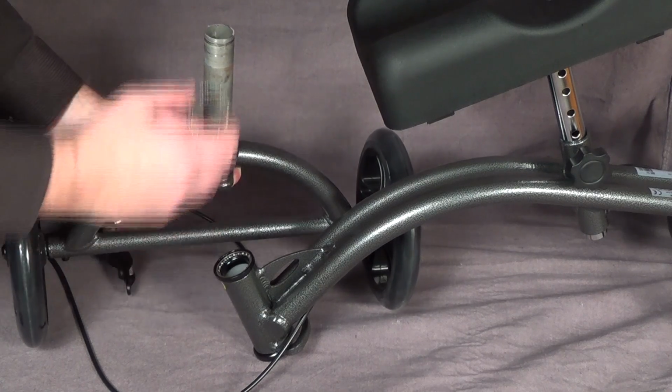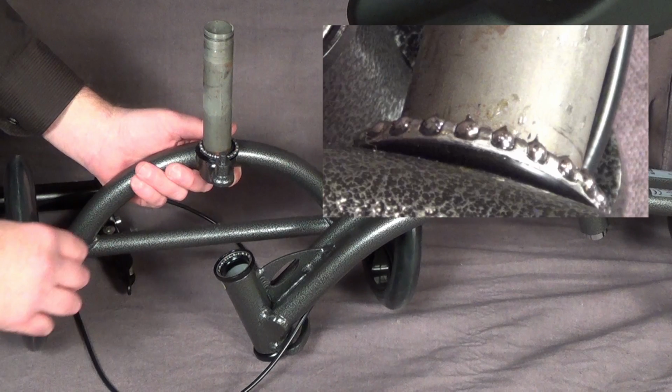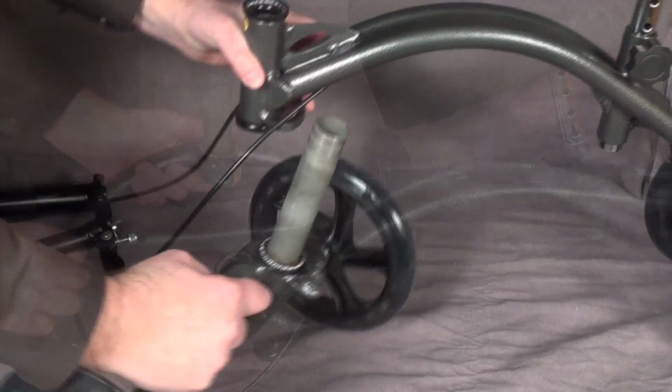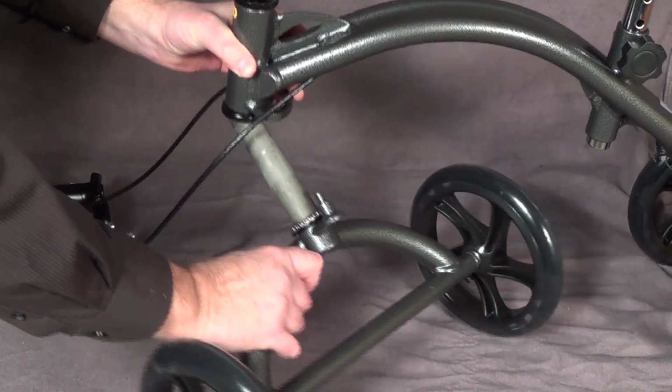Install the lower bearing ring onto the new steering fork as shown. Make sure you install the ring bearing side up. Install the new steering fork onto the frame.